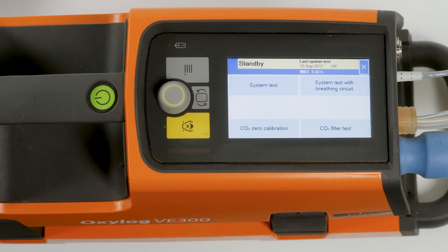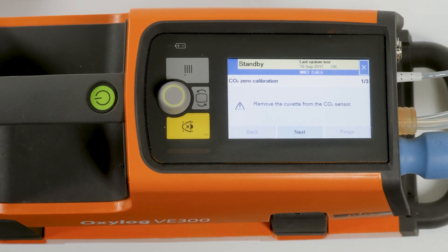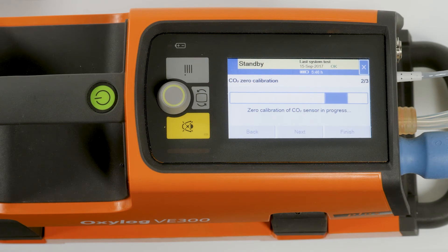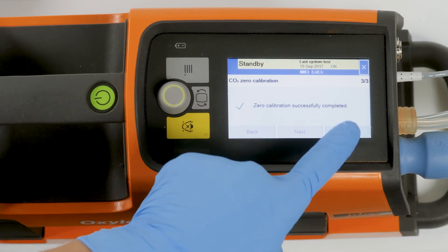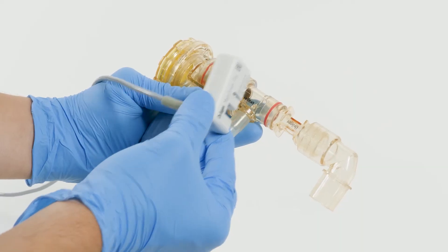To start the CO2 zero calibration, touch the button CO2 zero calibration. On screen one out of three, confirm the advisory message with the next button. The CO2 zero calibration starts and the message 'zero calibration of CO2 sensor in progress' is displayed. When the CO2 zero calibration is completed, a message is displayed indicating the result of the calibration. To exit, touch the finish button in the bottom right-hand corner of the screen.